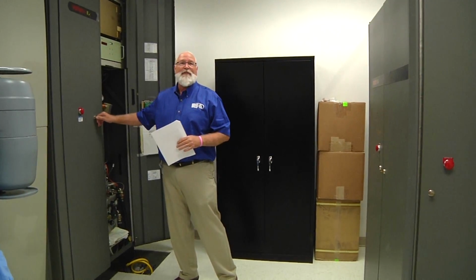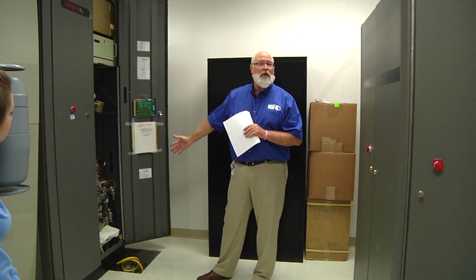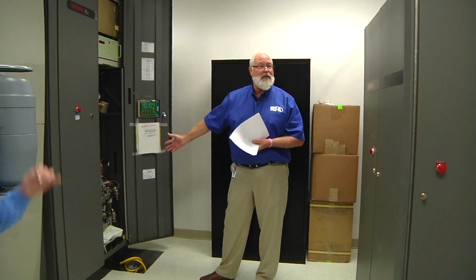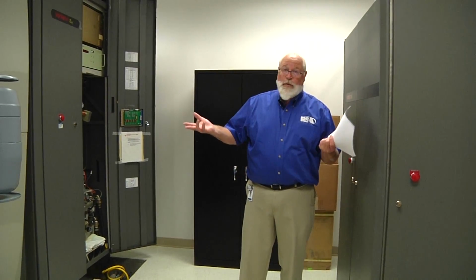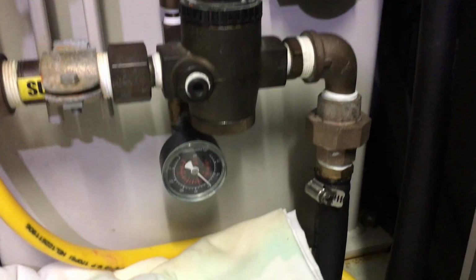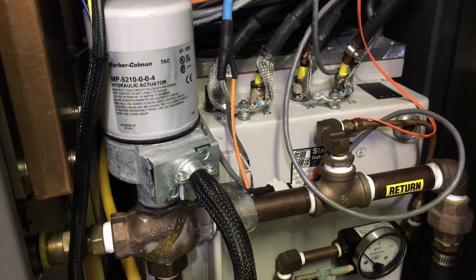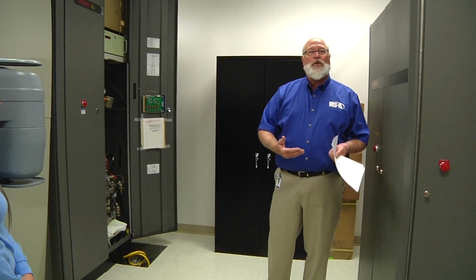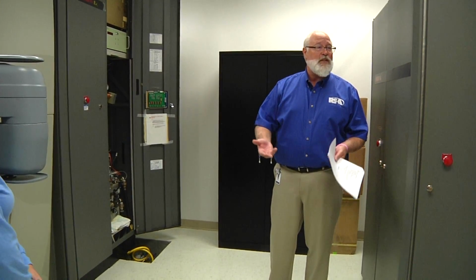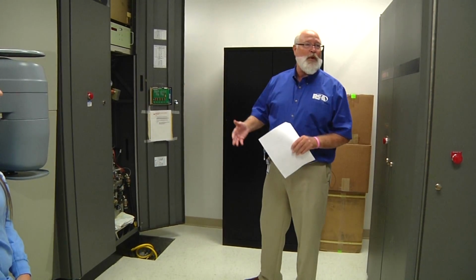Another thing that we might have you ask or look at is your system is cooled by water. It's either going to be cooled from the regular tap and flushed down the drain, or it's going to be attached to a chiller system, and that saves water. So we might ask you to look at these gauges to make sure that there are readings on those gauges, and we might say, well, it sounds like your machine is overheating. Maybe you should call your chiller engineer or your facilities engineer. Make sure there's water to the machine. Make sure the chiller is operating.